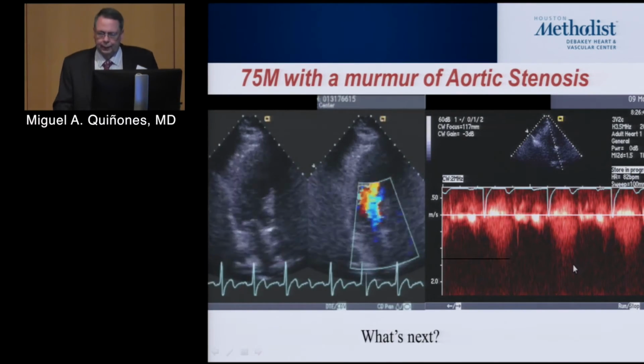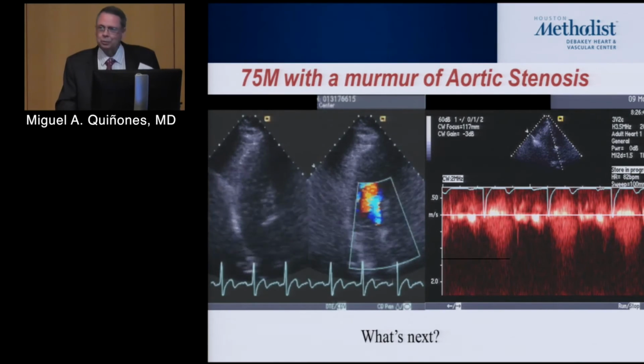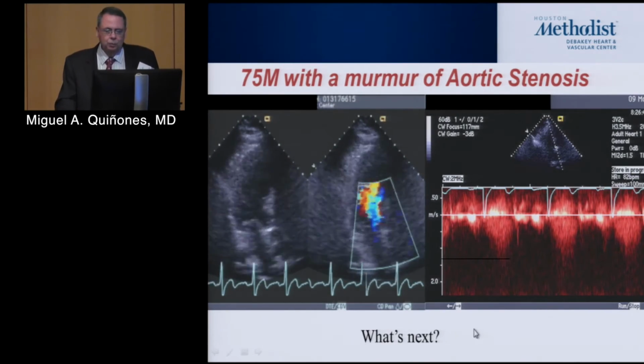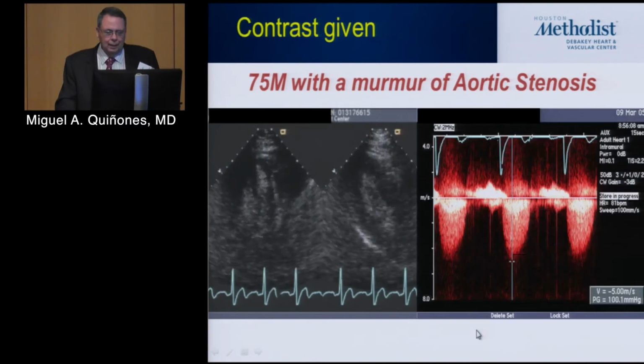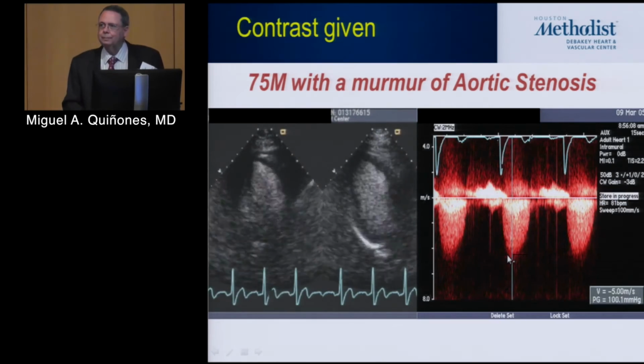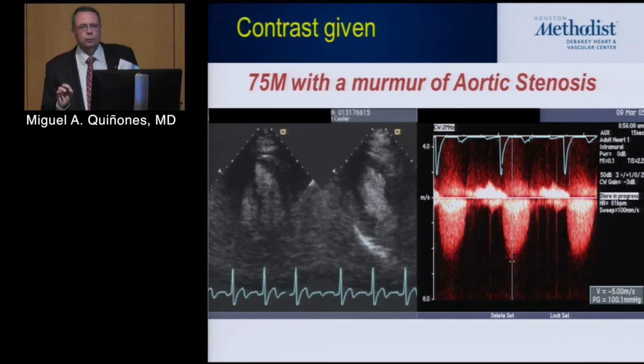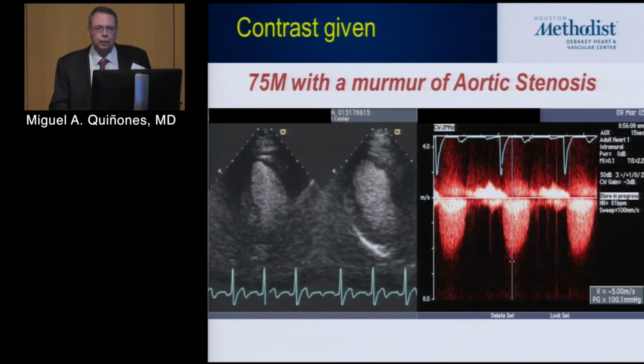And then at times, you get that. All right? So what do you do in that situation? Well, today, you spend an extra $100, and you grab a little vial of contrast, and quite often you can get that, okay, and save the day. So contrast can be extremely helpful when you have tried everything and you don't get much of anything.